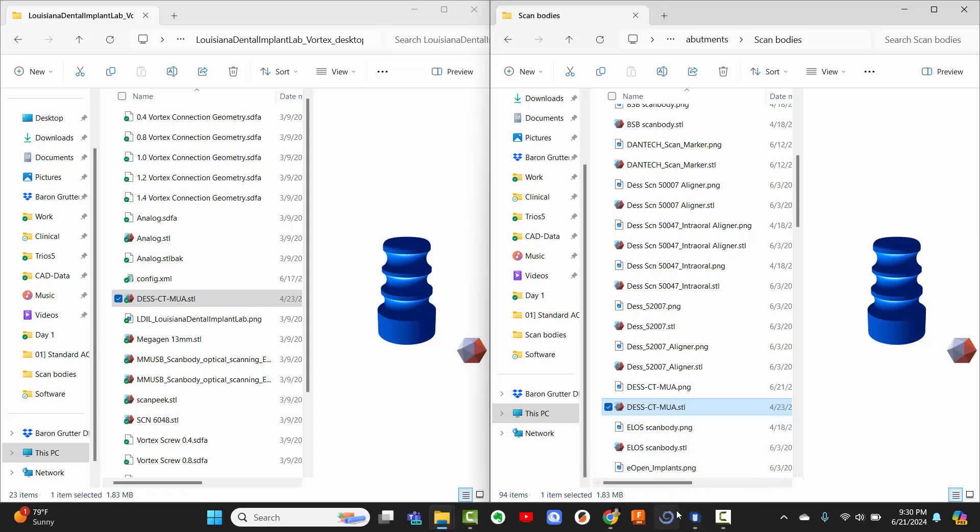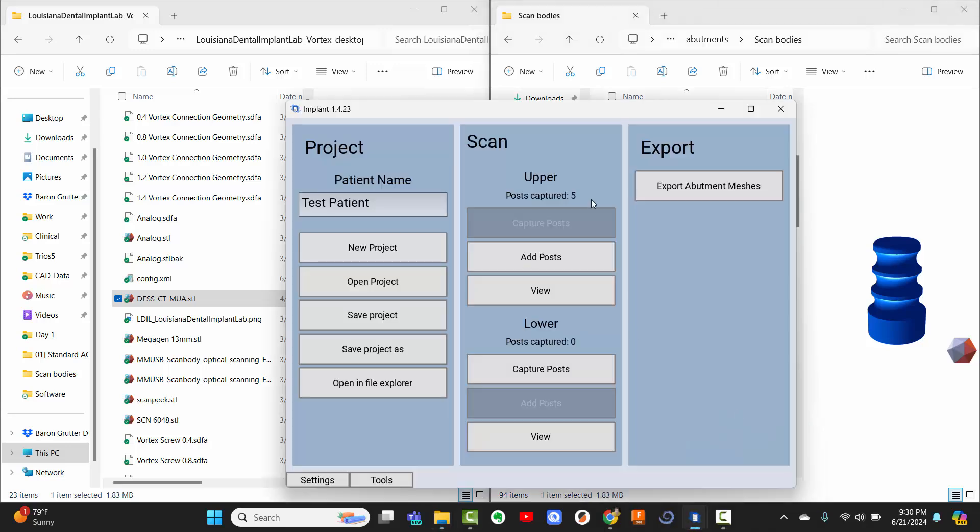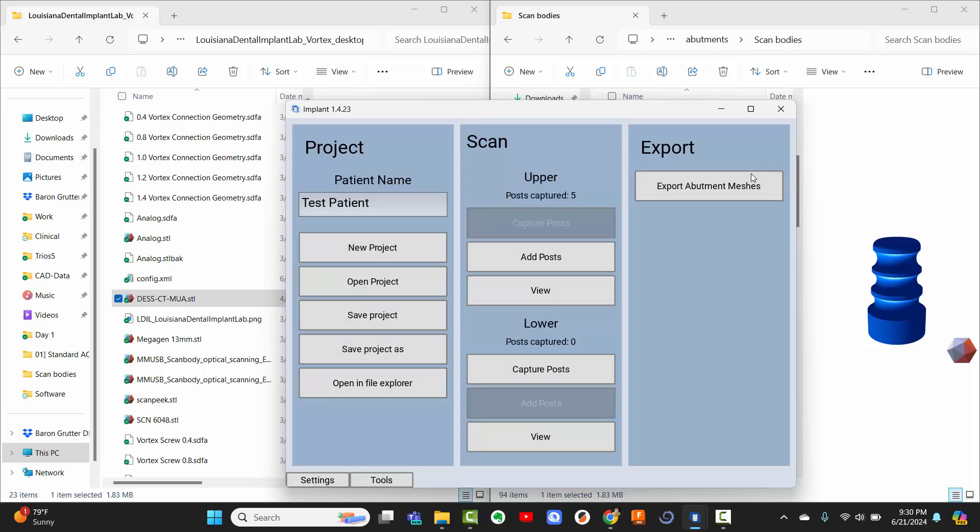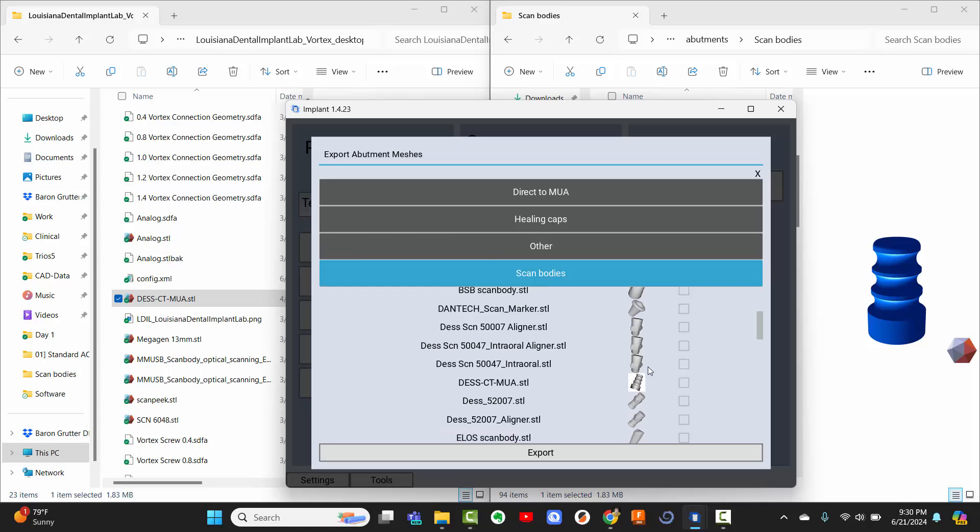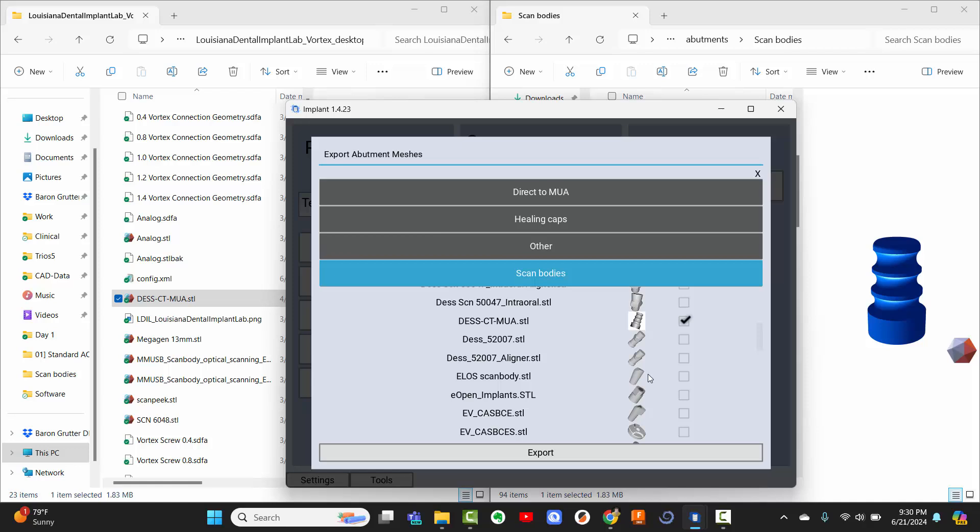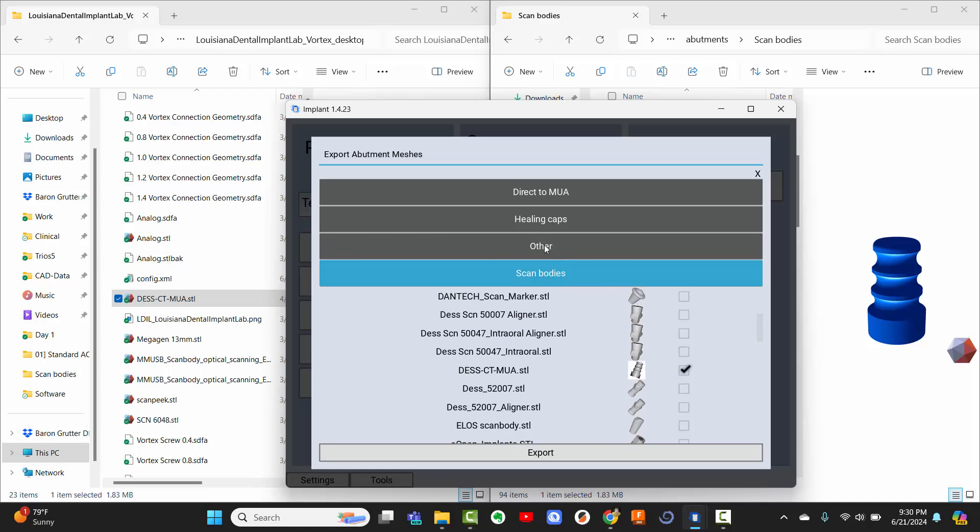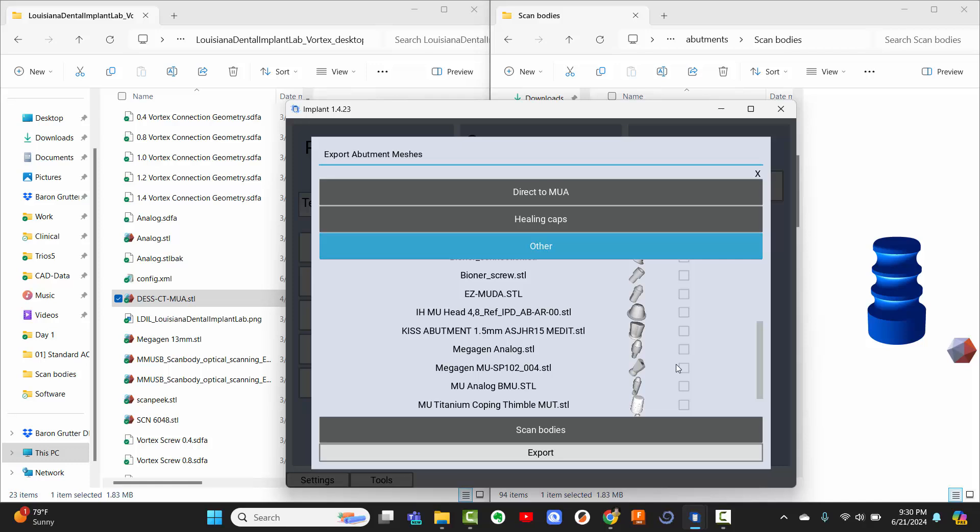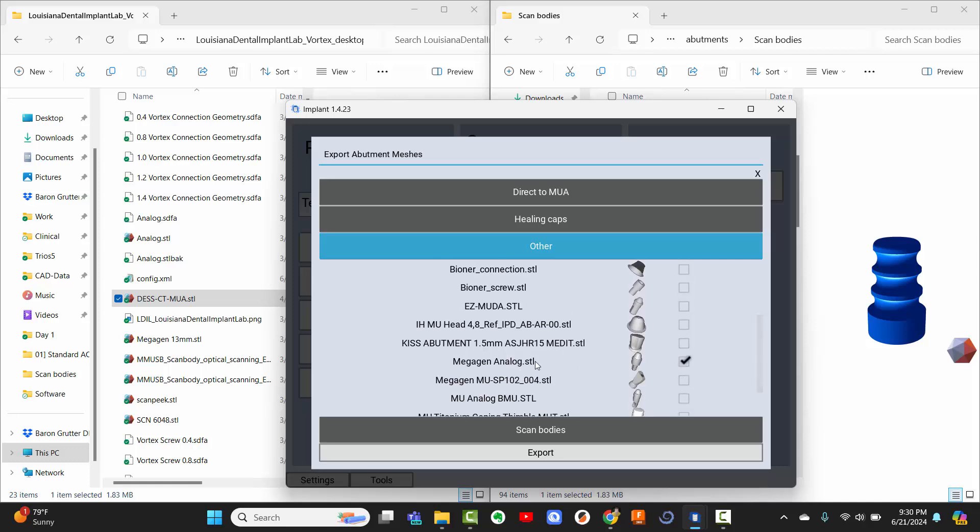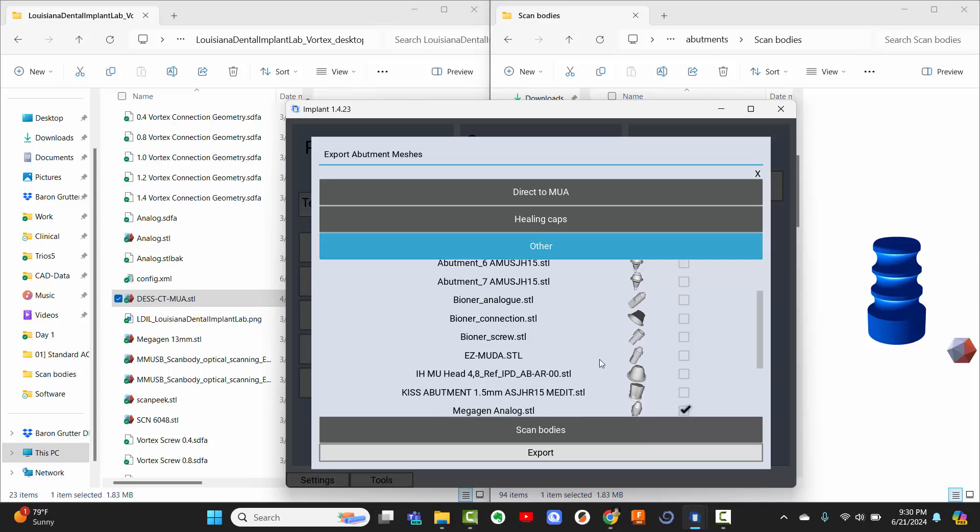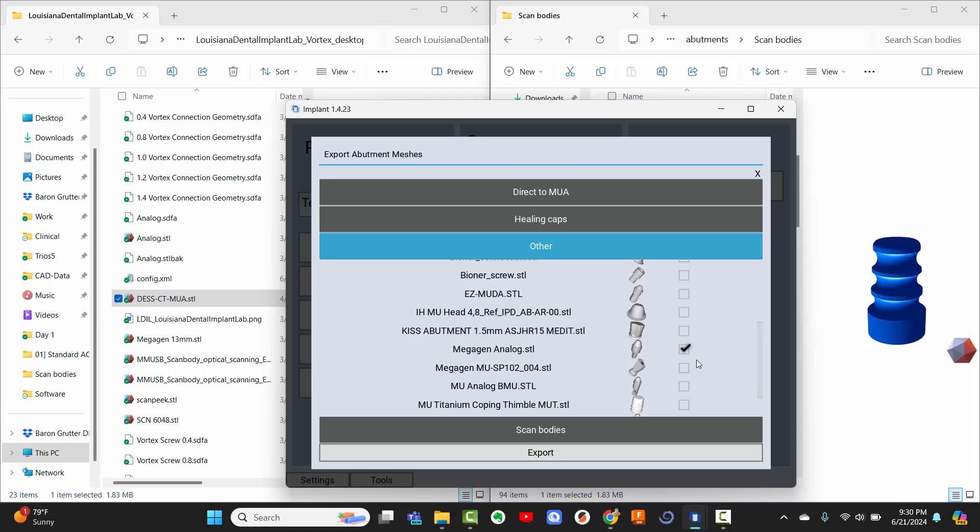So now if I come into my implant scanner software, and I already have a scan up, you can see that here are the scan bodies having been scanned, and I go to Export Abutment Meshes. Now I can come down here and there it is. Here's my DESCT MUA, click on this, that's just a file name I created, I don't even remember what it's for, to be honest. And as an example, you can check everything if you wanted, you don't do that, but you could export any of these you want if you want to export multiple. For example, I'm going to go ahead and also export this analog. I use this one simply, I actually don't carry it in my office, I use the VSB one, but this one happens to be in a different library, so it doesn't matter.